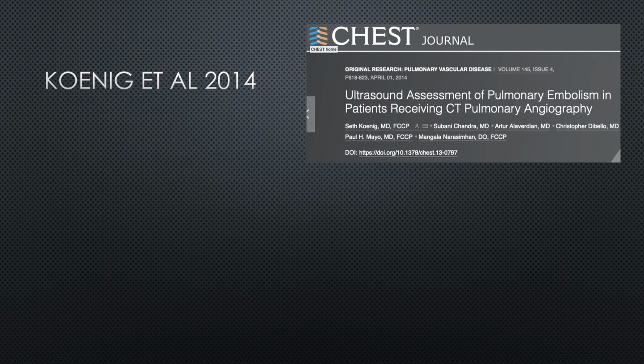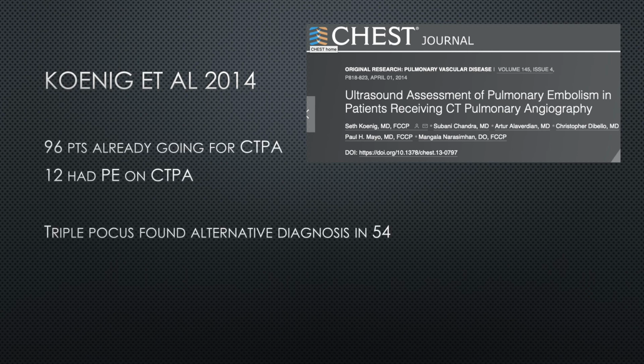This paper by Koenig is like a mini version of Nazarian. So it's published in Chest, the same journal, in the same year as well, 2014. Fewer patients, but they also found that if you have a triple PoCUS that is negative for PE and finds an alternative diagnosis, in all 54 of those patients, CT didn't add anything further.